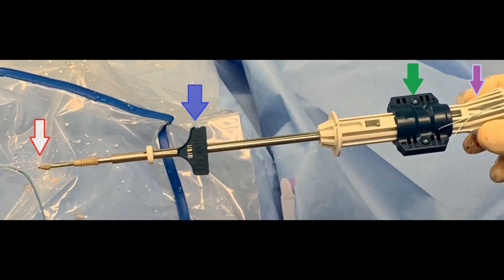These tails are then placed through the kite at the tip of the self-punching anchor, as seen by the red arrow. To load the sutures up through the anchor, the blue tab is pulled, as noted by the blue arrow.